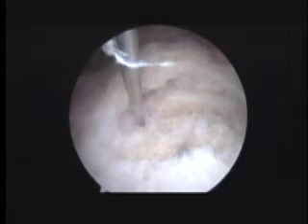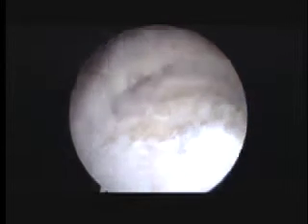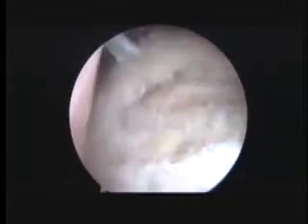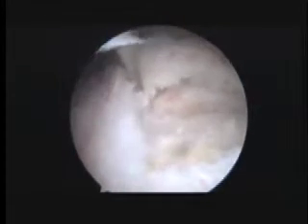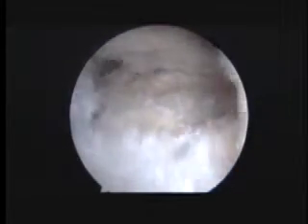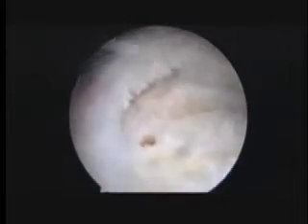So we'll make a little nick in the skin. And then we'll take an instrument called a punch. And Kendall, come down and just rotate for a minute, just a little bit like that. Just like that, that's all we've got to do. With this instrument, we can first lift up, make sure we can see everything that we need to see. And then we're going to place that first anchor down right about here.